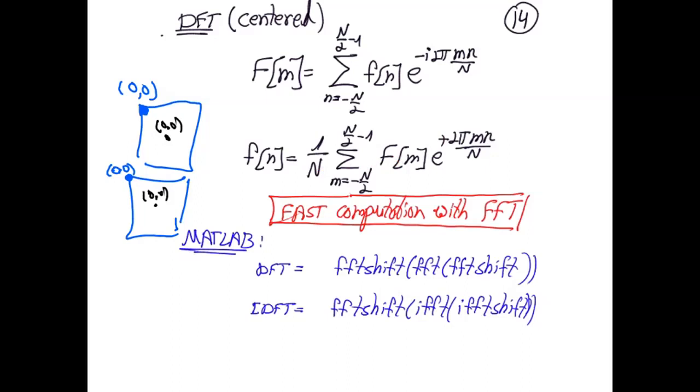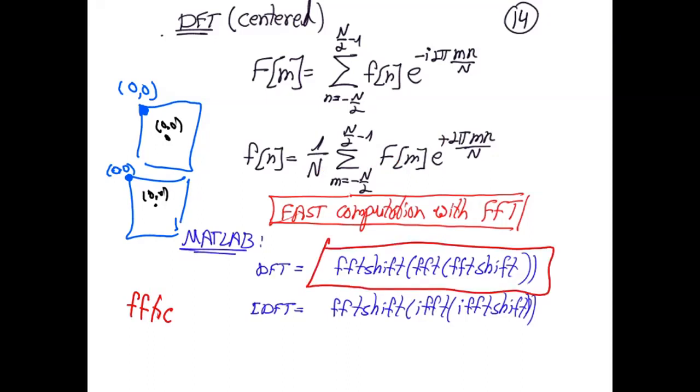So one of the first things you do as an MRI scientist is write a function, FFTC, which implements this, so you don't have to do the FFT shift all the time. Every MRI scientist either takes an FFTC function from a colleague, downloads some package somebody else wrote, or writes their own, because otherwise their images are not going to look right. Does that make sense? Okay.